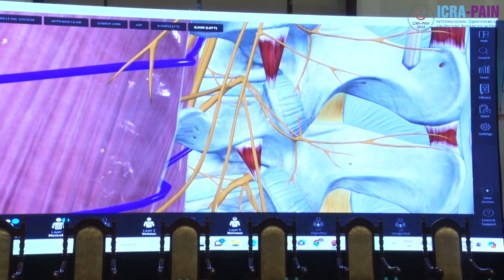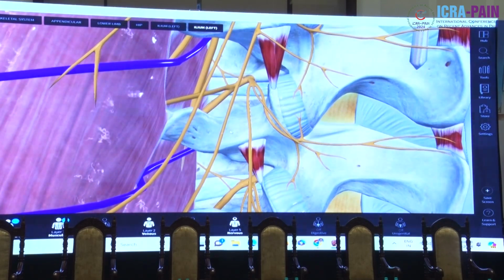Right? But anesthesiologists are more accustomed to the erector spinae block. So for the erector spinae block, where should the needle be placed? Erector spinae blocks which nerves? All the dorsal rami branches. Because here our needle is placed over the transverse process, and all the dorsal rami branches are resting over the transverse process. So for the erector spinae block, you place the needle anywhere here over the transverse process, and you are going to block these three. So this is known as the erector spinae block.